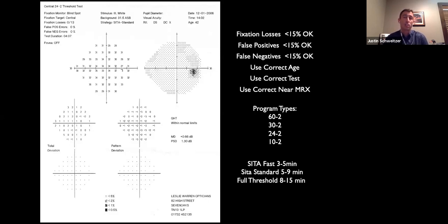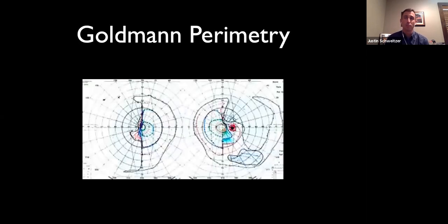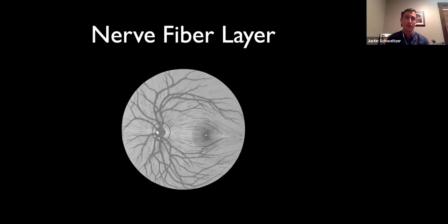So the Faster could take 5 minutes if it's a patient that has moderate glaucoma, but it's about 30% faster than SITA Fast. So keep that in mind. So anywhere from, I've seen again, as fast as a minute and a half to 2 minutes up to, it could take longer than that. So I apologize, I answered your question incorrectly there.